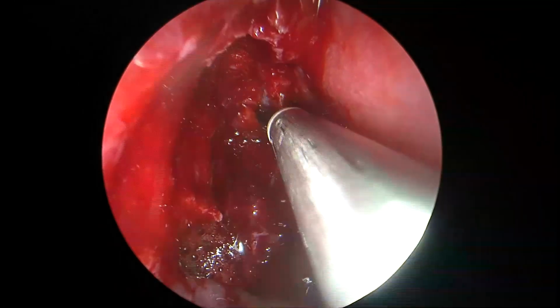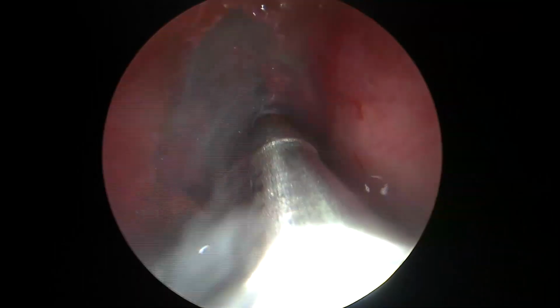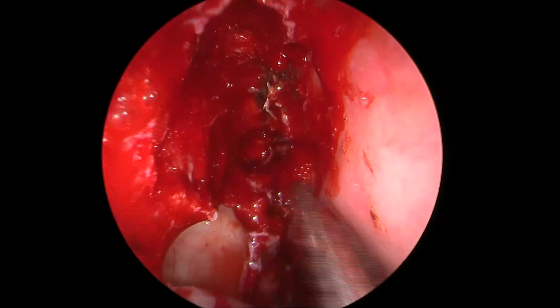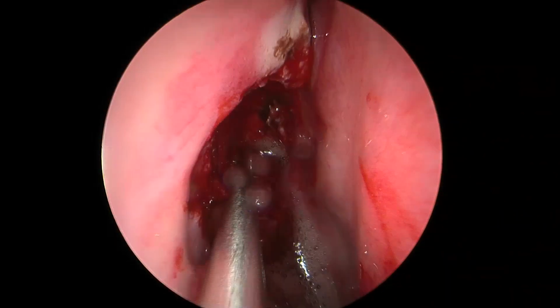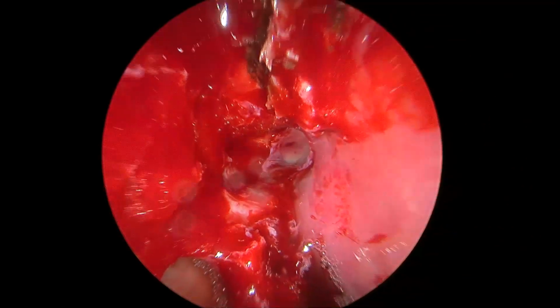And now what we are doing is, before we proceed further, we are just coagulating this sac. And this is very important, foremost for taking care of any vascularity that these small meningeal sacs may contain. The last thing you want to do is create a hemorrhage that tracks intradurally, and to avoid that, all meningeal sacs have to be nicely coagulated before they can be resected and repaired.